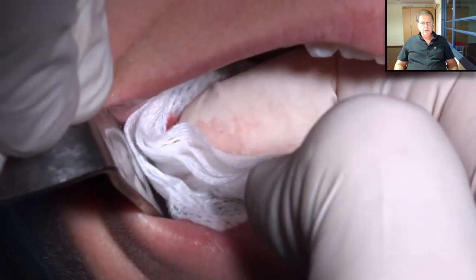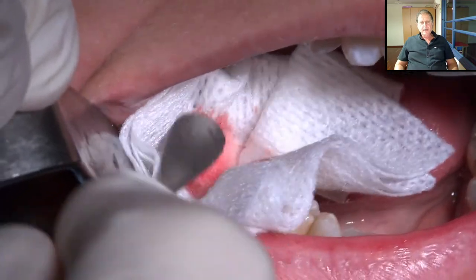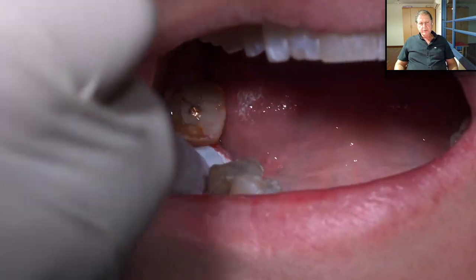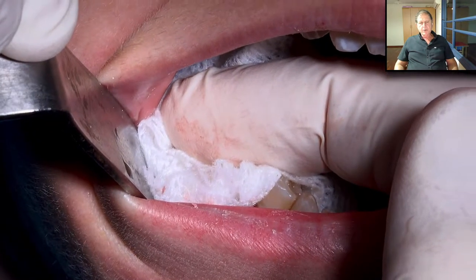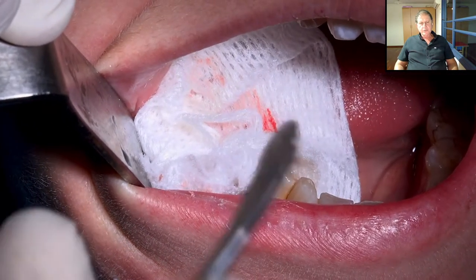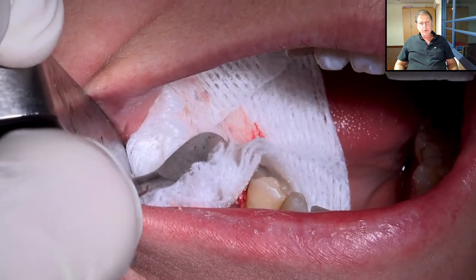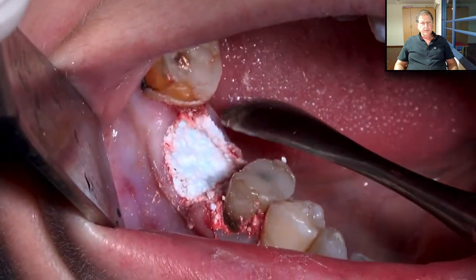Take a dry gauze and press strongly with a finger — it's very important to press strongly. Then immediately add additional compaction with a periosteal elevator, about three seconds each time. We add a little bit more, press again, take the periosteal elevator, and add additional compaction. This is very important: material that will not be compacted will not give you the same result.